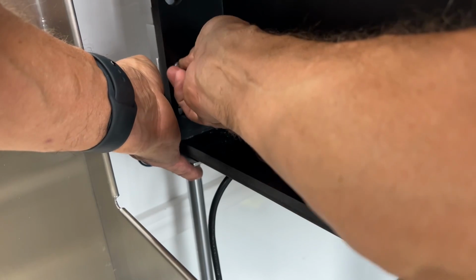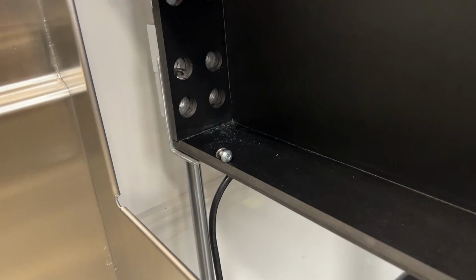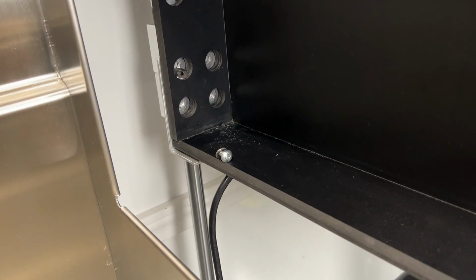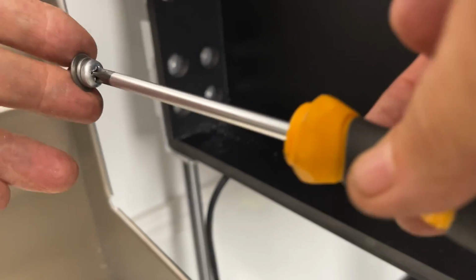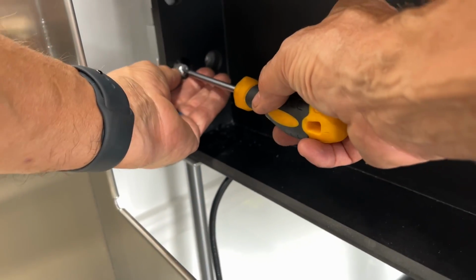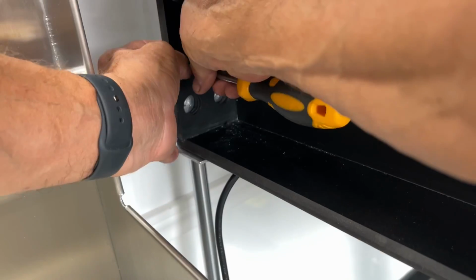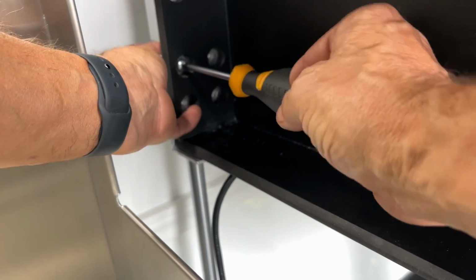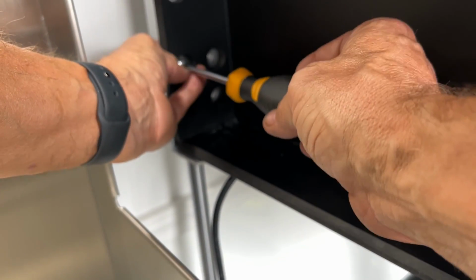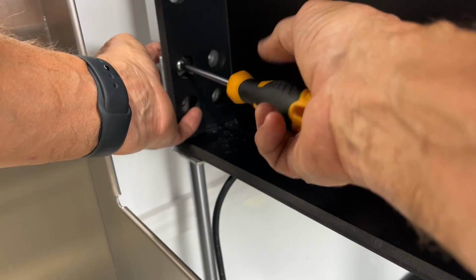And this is where you'll see that it's not such a good idea trying to do it with your fingers, because the black box is so thick that you can't really hold on to it. So I'd highly recommend that you take the screw with its washers and put it on the end of a screwdriver and hold the screws on there until you get it in the hole, and then use the screwdriver to start the screw, and your other hand wiggling the bearing to help get it started on the threads.